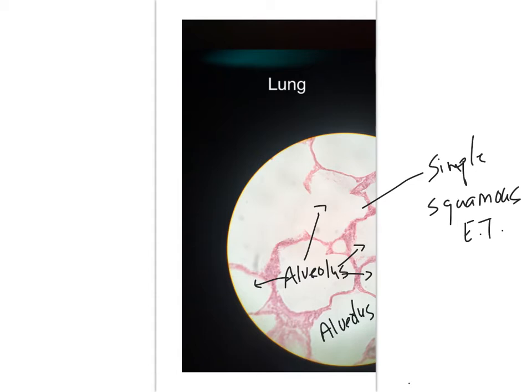Now, the capillaries are small little circles, okay? And they tend to be in thicker areas. And again, y'all, they will be small. So if you look right here, you see that little circle, or over here, another little circle. These little circles represent our capillaries. Or again, a singular one, just capillary.